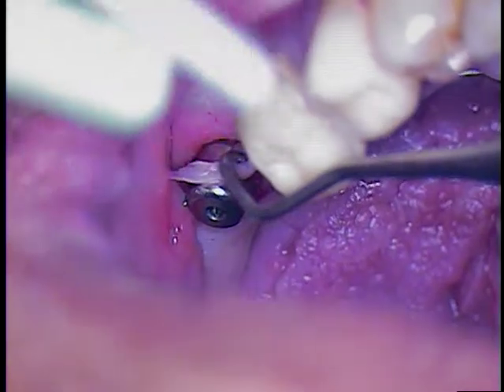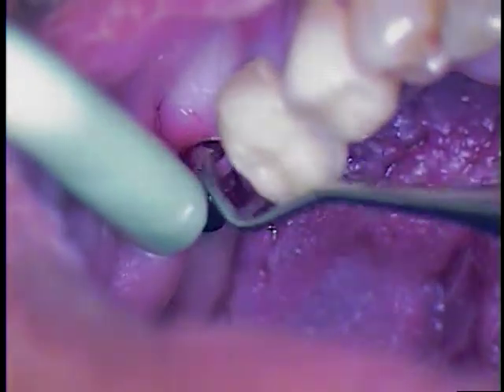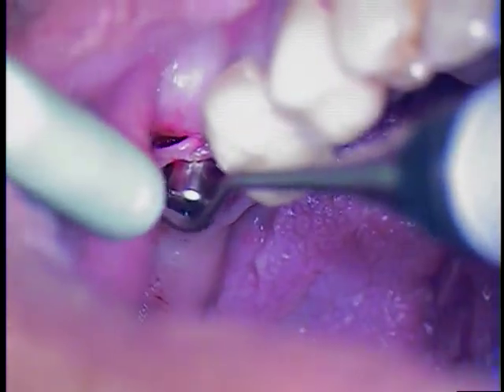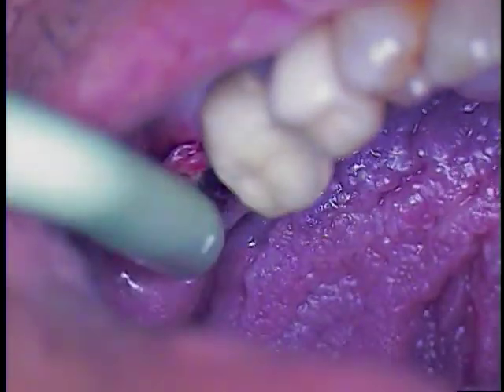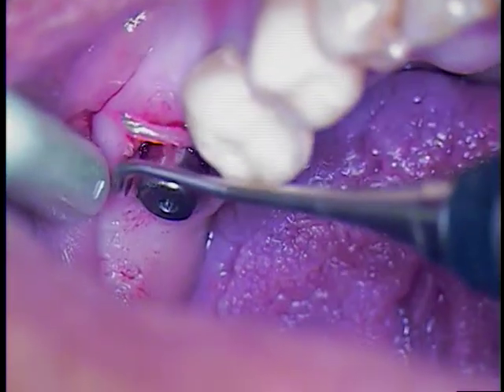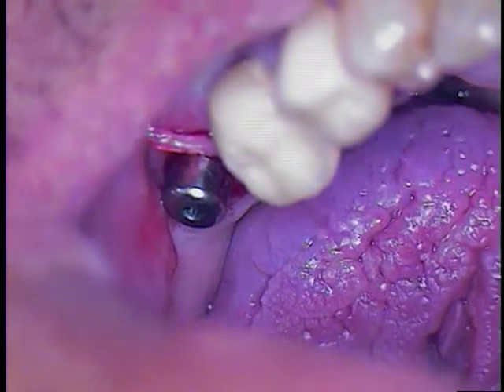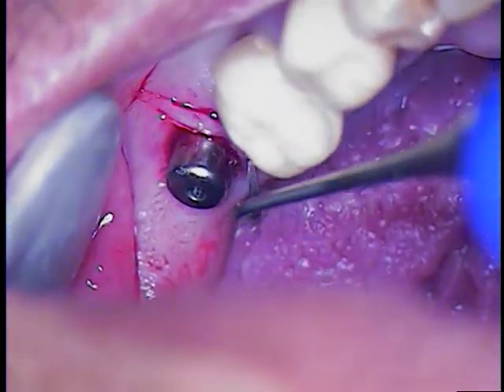Need a white surgical suction in room one, please. We did a good job around the buccal aspect. We're coming around the distal. We're going to grab a white surgical suction now and get rid of all this excess tissue right here.